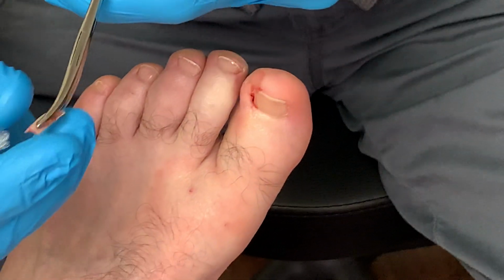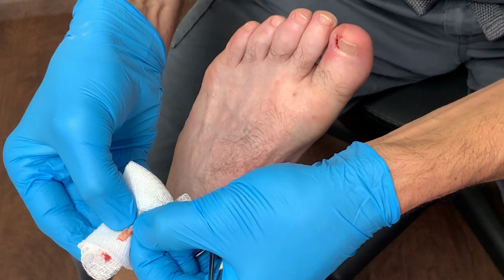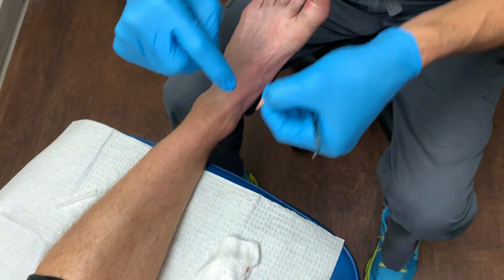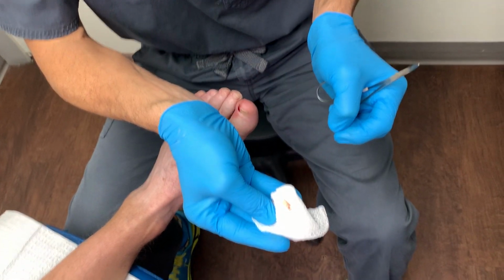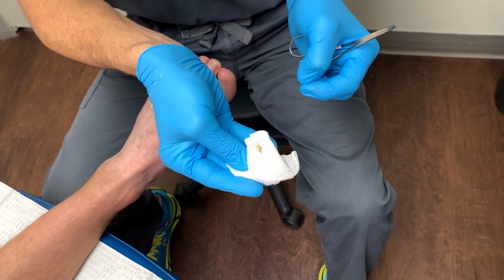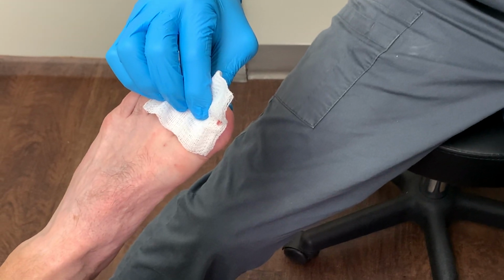Okay, so this is what they were looking for, right? I'll show you guys. Look at this. You see this? Let me put it here for background. That's what they couldn't get. They couldn't get that little piece. I'm going to turn it around for the patient so you can actually see it here. So they were able to get this part, but they couldn't get that little piece, that little sharp tooth. And that's the problem. No matter how hard they tried, they weren't able to get it. And just like that, problem solved.